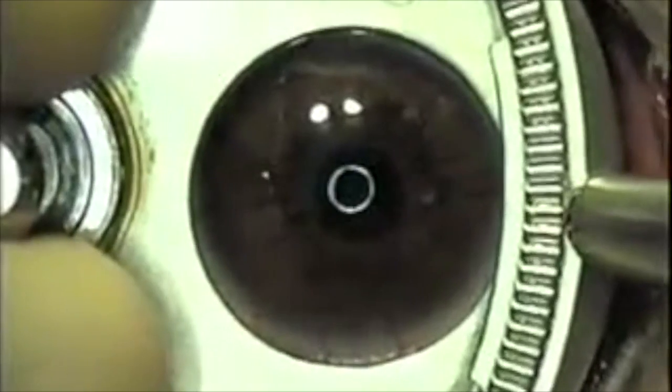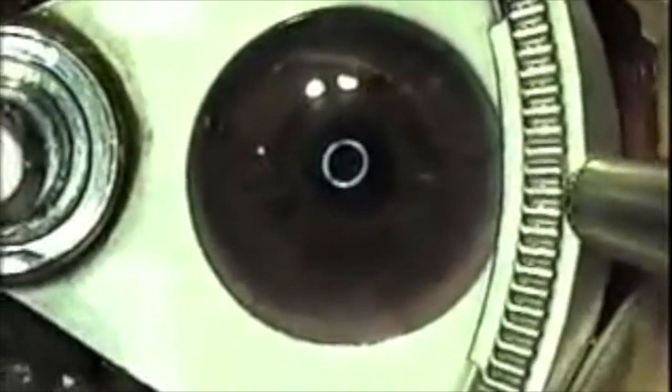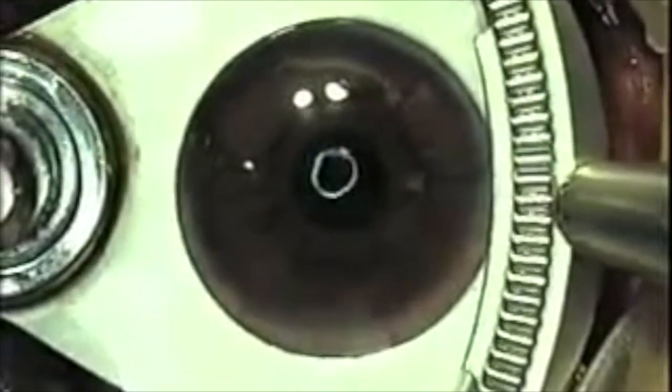So this device is called a suction ring, and what it does is it keeps the cornea intact, in the same position, so the scalpel or another instrument that they're using to cut the corneal flap doesn't cut another part of the eye. And with this suction ring, there's another part that he just applied. It's called a microkeratome. It's just another device to cut the corneal flap of the eye. It's also known as a can opener because of the movement it's making.